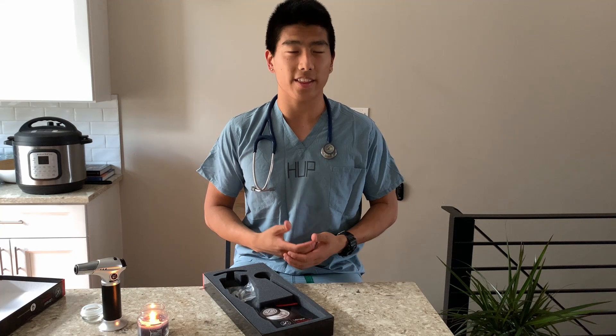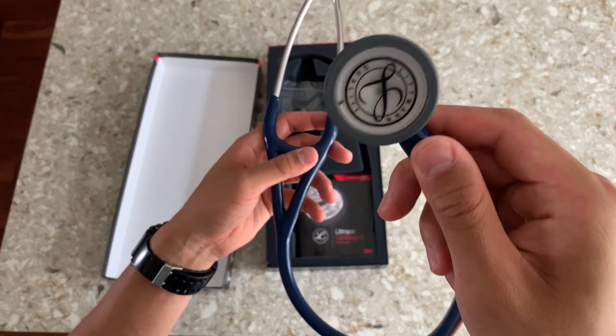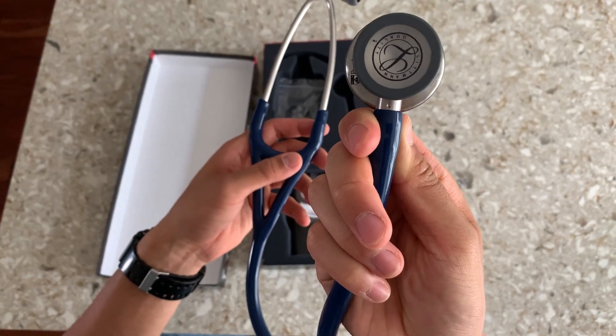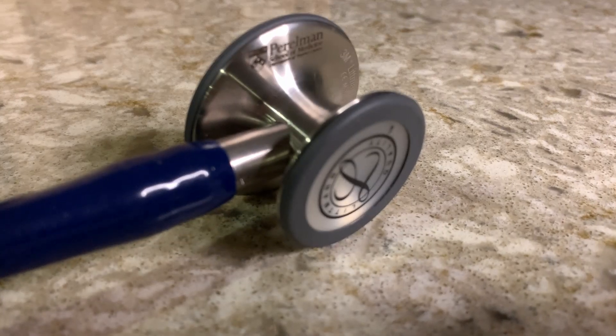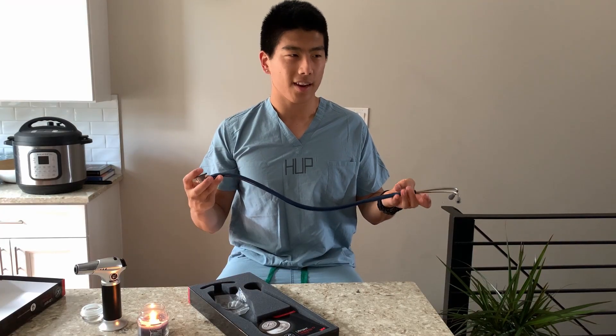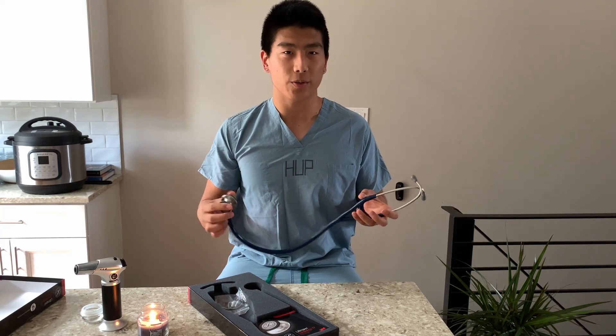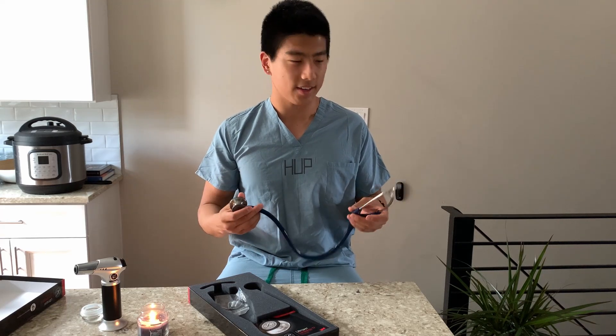And it kind of has some weight to it too. Over my neck I can definitely feel the weight of the stethoscope, so hopefully that means it's really heavy duty and really high performance. Here you can appreciate the blue color and the nice chrome finish to the chest piece. There's actually an engraving of the Perlman School of Medicine logo right here on the chest piece. This is the first time that I've really held a stethoscope, so I don't really have any standard to compare this to. But I like the weight of it, I like the feel of it too.